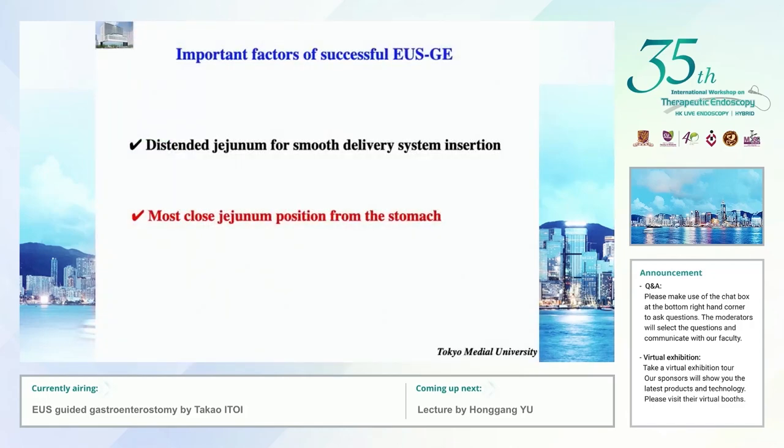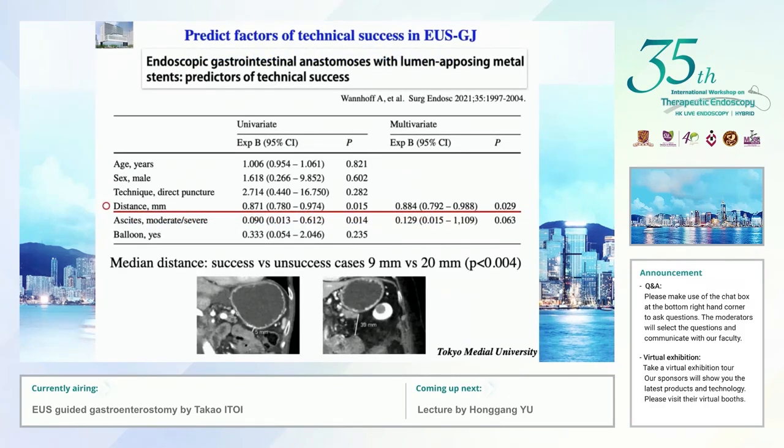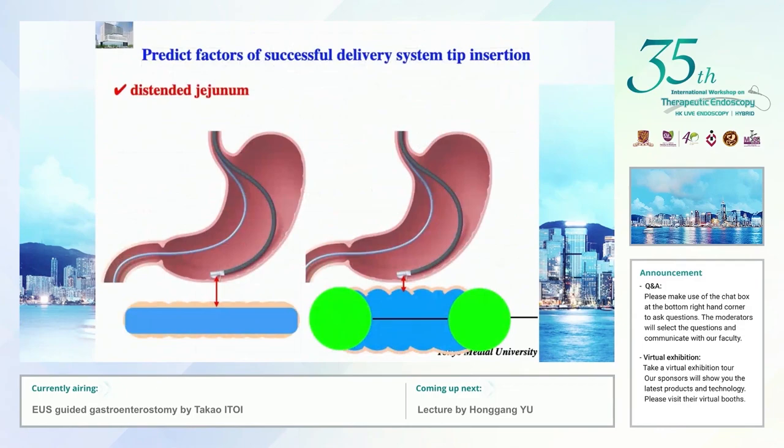Another factor is that the jejunum should be located at the closest position from the stomach. One interesting study showed that the ideal median distance between the jejunum and stomach for successful EUS-GE was less than 9 mm. In this aspect, in the case of a longer distance, the double balloon tube makes it possible to dilate the jejunum, leading to a short distance between the stomach and the jejunum.